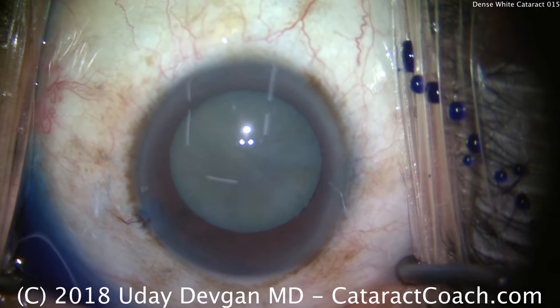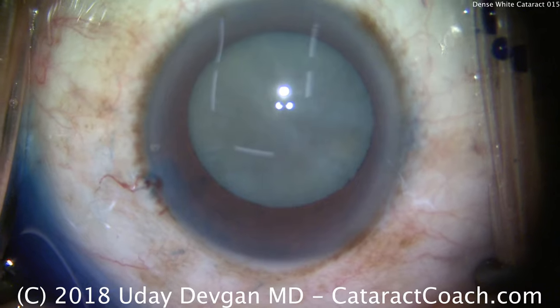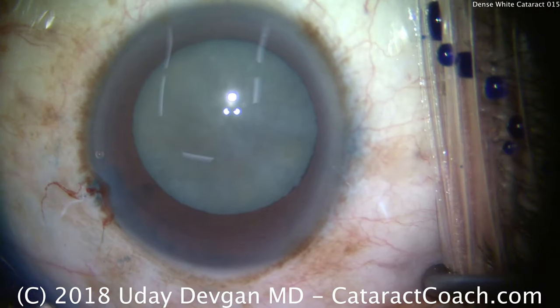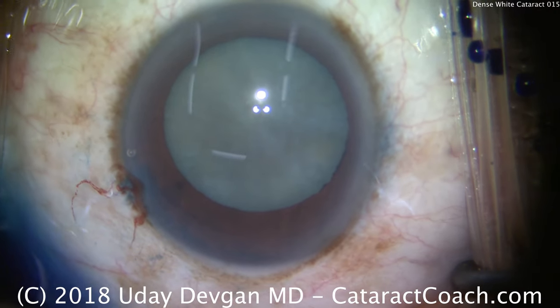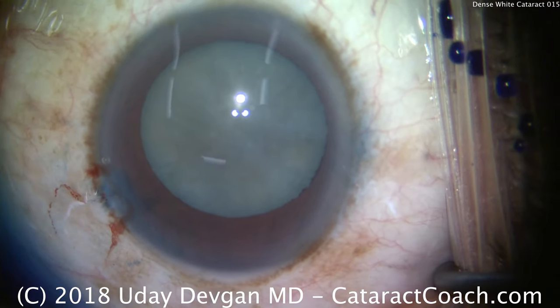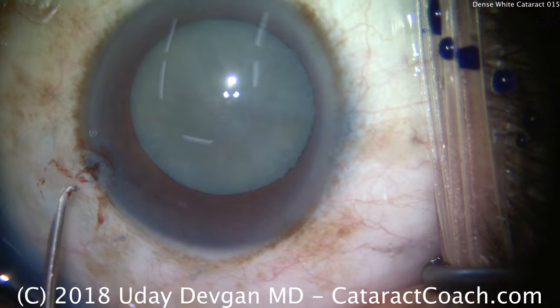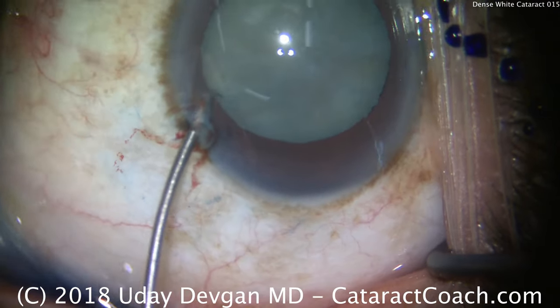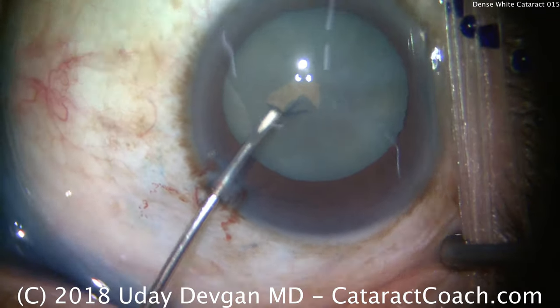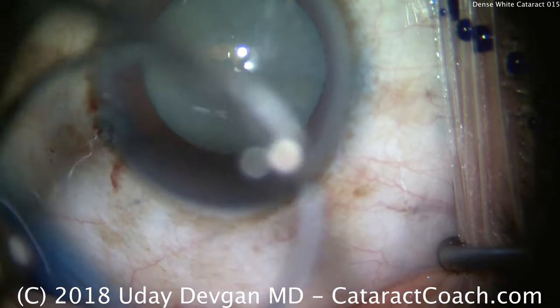Now, before you make the main incision, let's make sure this is not intumescent — let's make sure there's not fluid in there. When I put the viscoelastic in, I put the eye pressure high, so the IOP now is probably 40 — that's pretty tense, 40 maybe even more millimeters of mercury. A little more viscoelastic. Check the pressure now — nice and firm. We'll use a cystitome. I don't normally use this, but I want to keep the AC pressure high — I want the anterior chamber pressure higher than the intralenticular bag pressure. We'll start opening a rhexis there, and no fluid came out. So this doesn't appear to be a milky cataract.